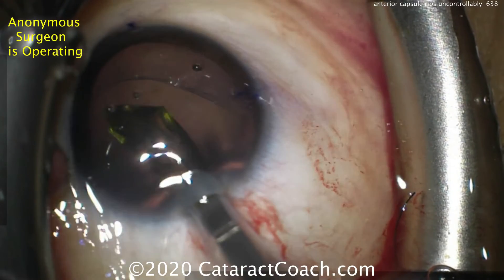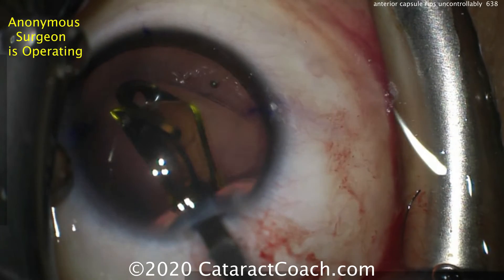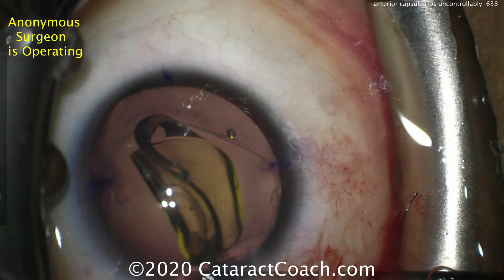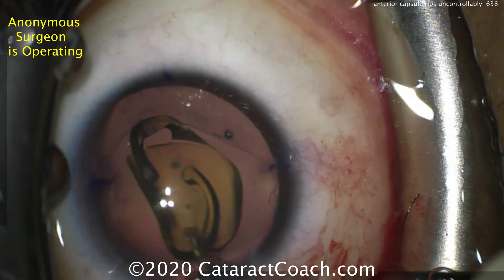A little more viscoelastic — here comes the lens. It's a single-piece acrylic lens, trifocal as well as toric, and that's going to go in the eye very nicely and gently. Then it'll be positioned so that the dots of the toric lens are lined up with the steep axis markings.